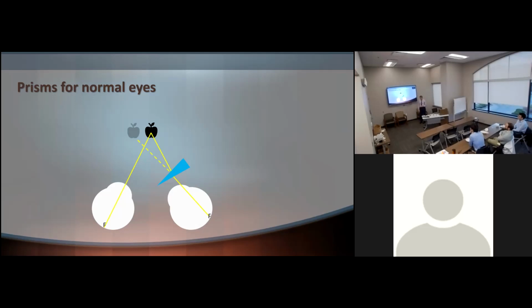But then the eye cannot tolerate this double vision because it's a normal eye. So what happens, the eye will adduct. So the medial rectus will contract to bring the fovea point F back in control, and that will be aligned here, and the patient maintains binocular single vision. So by holding the prism base out, I have induced temporal displacement of the image that induced convergence, right?